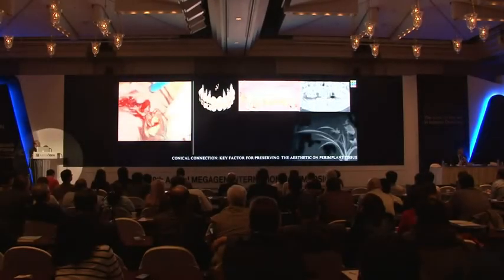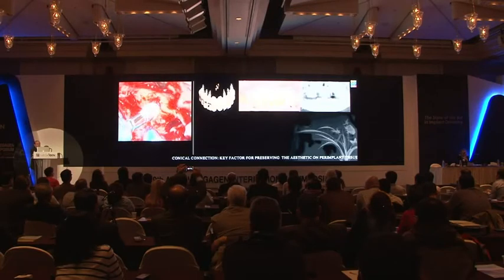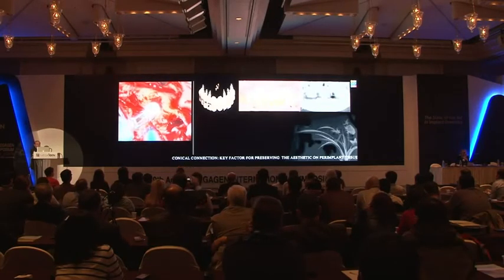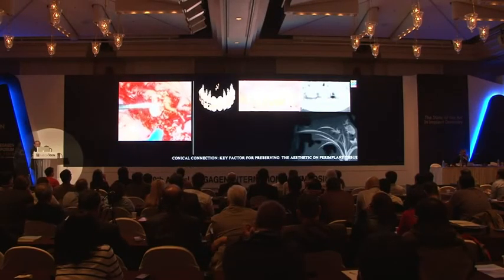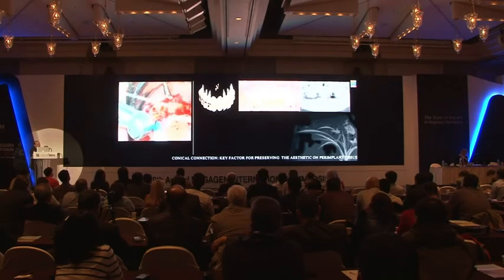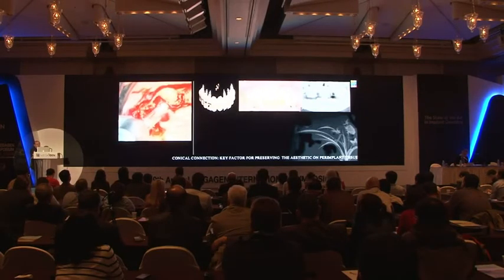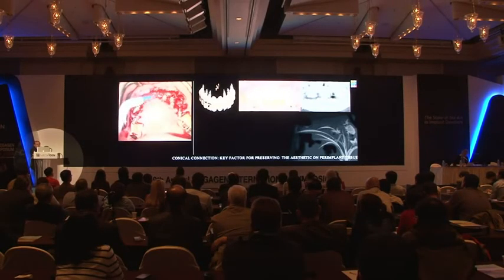And this is the second case in which we planned an immediate implant placement after the extraction. Even if we can't avoid losing the bundle bone, using the biomaterial helps us maintain the buccal bone profiles.